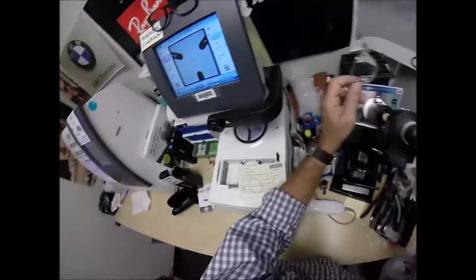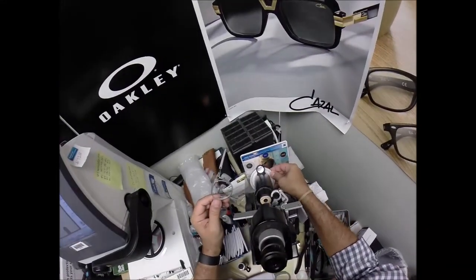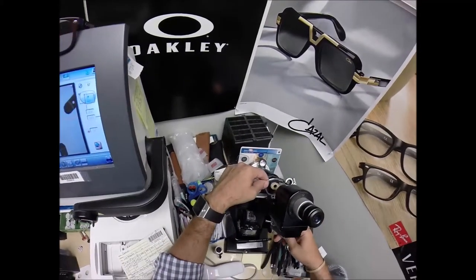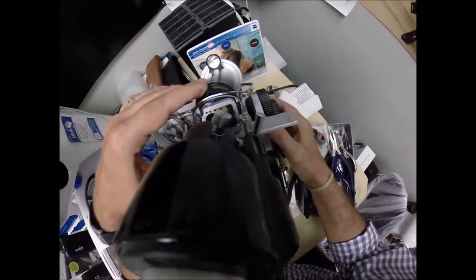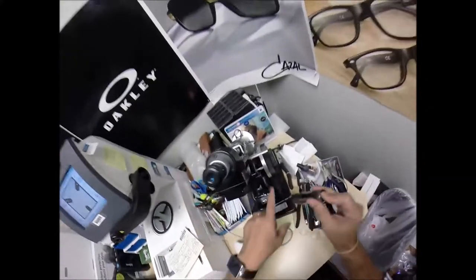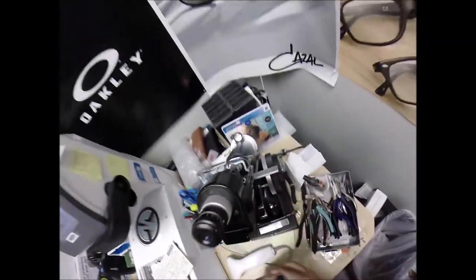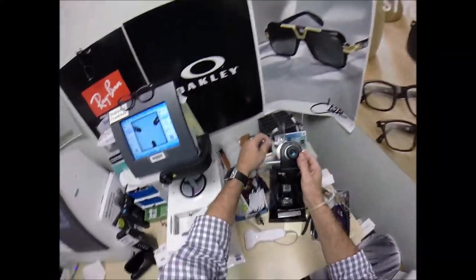Come down here to the lensometer, spin the axis wheel to 75, which corresponds to the astigmatism of your left eye. Put that in there. Read the power. Minus 6, exactly halfway between 5 and 7. That's where you're going to find 6. Half a diopter of astigmatism correction, minus 650. So that is cut perfectly.